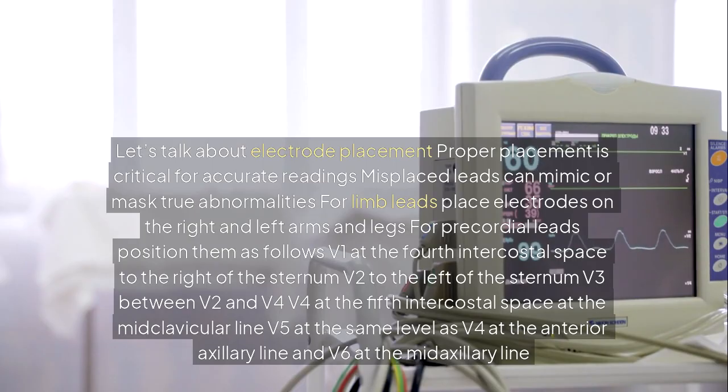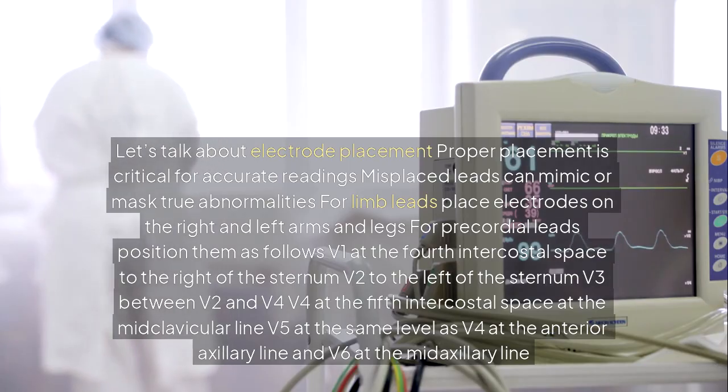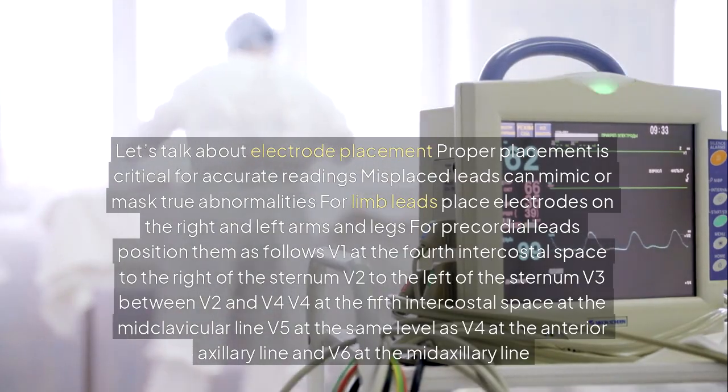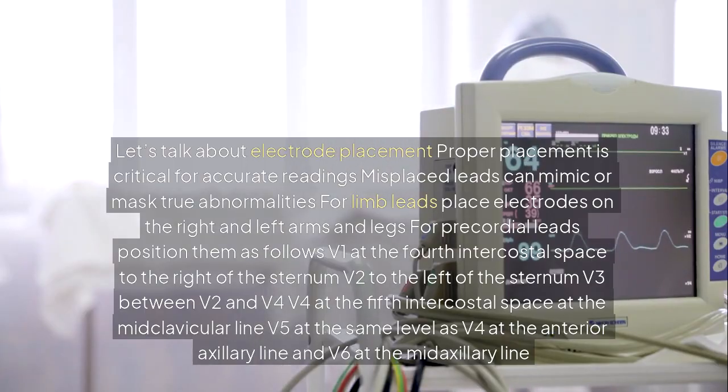For limb leads, place electrodes on the right and left arms and legs. For precordial leads, position them as follows: V1 at the fourth intercostal space to the right of the sternum, V2 to the left of the sternum, V3 between V2 and V4, V4 at the fifth intercostal space at the midclavicular line, V5 at the same level as V4 at the anterior axillary line, and V6 at the mid-axillary line.